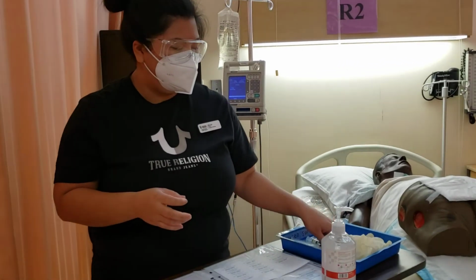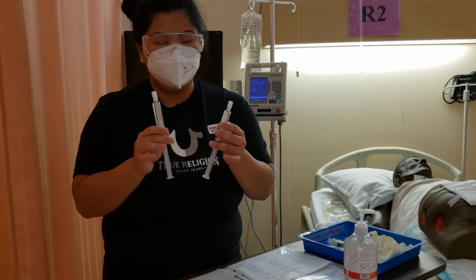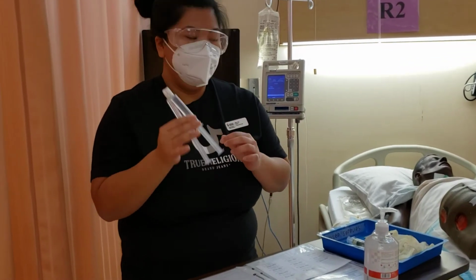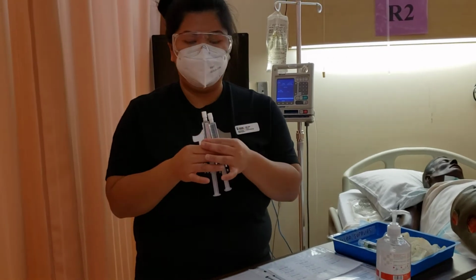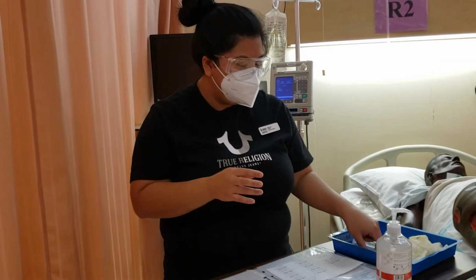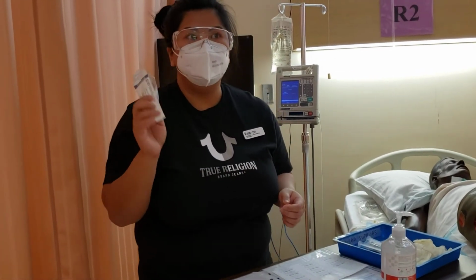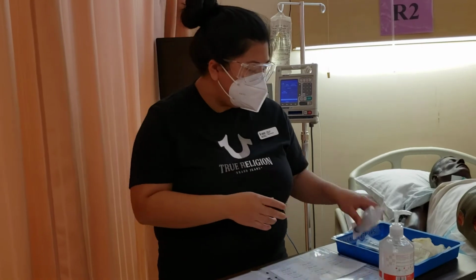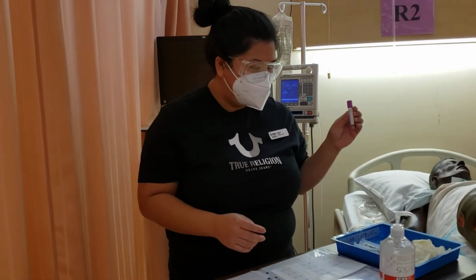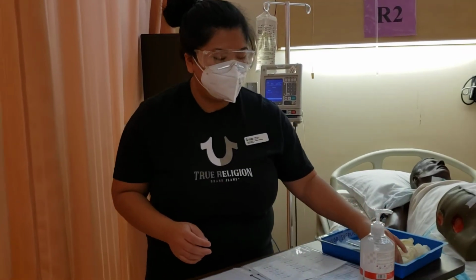We'll also need 2 post flushes. These are 10 cc normal saline prefilled syringes. Same thing with the heparin, this would come in a package in the clinical setting. And then I have my 10 mL empty syringe to aspirate the heparin that's currently in the lock. I have my blood tube, so our order is for CBC, so we have a lavender tube. We have our vacutainer, clean gloves, and alcohol swabs.